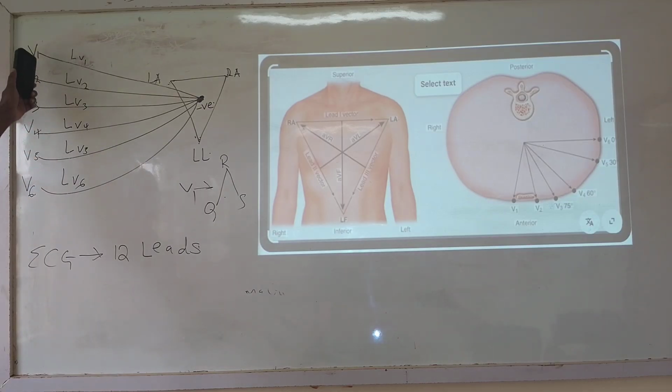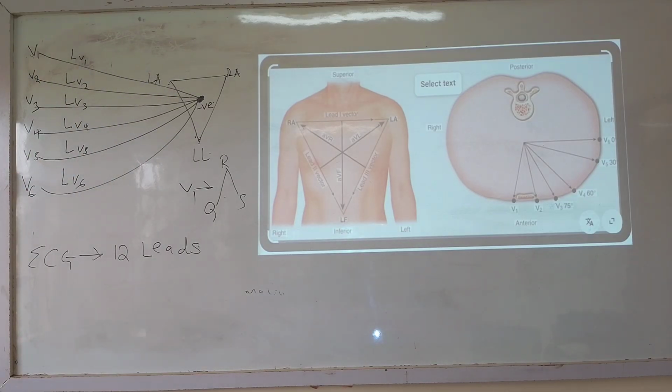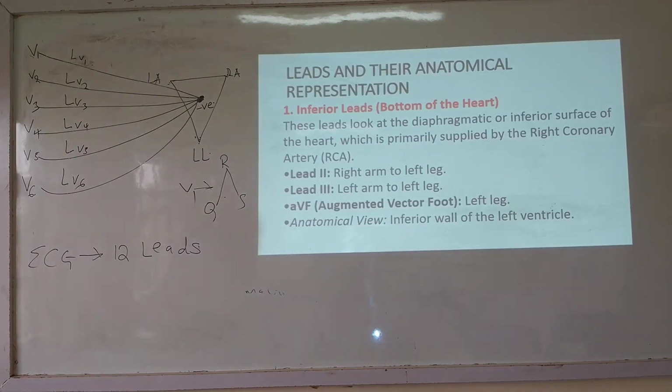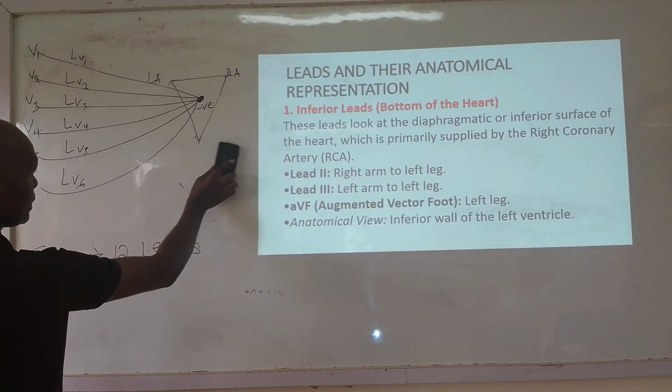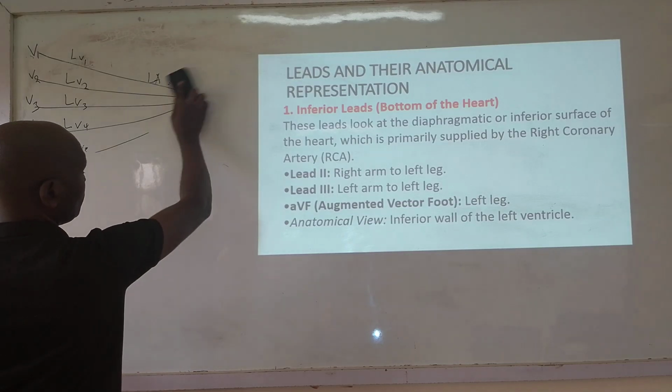That is why it's important to know where each lead checks. We shall see as we progress, and that is the next slide. That is what it is demonstrating.